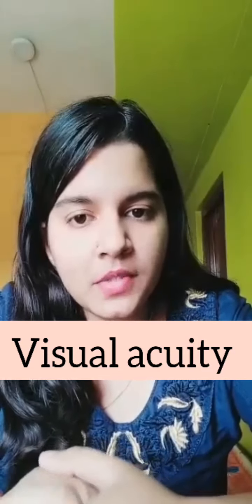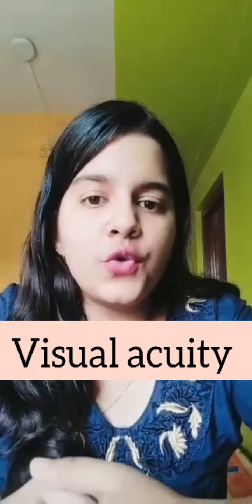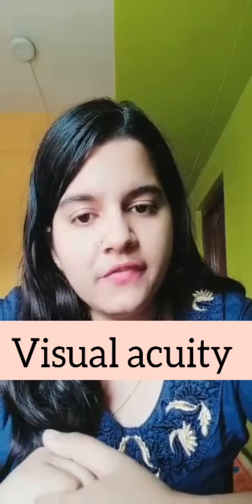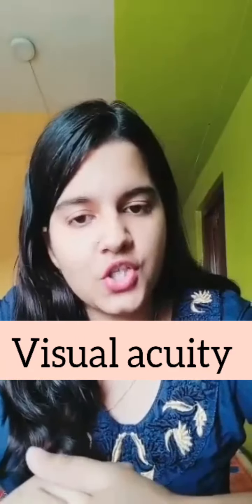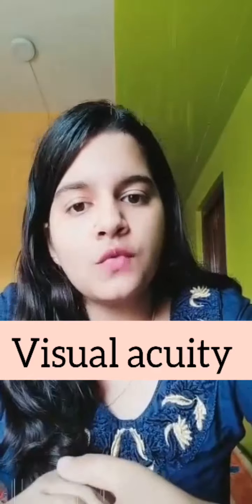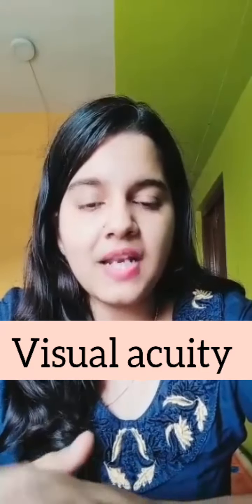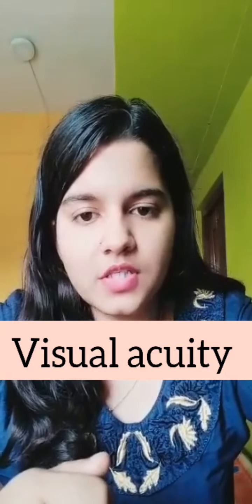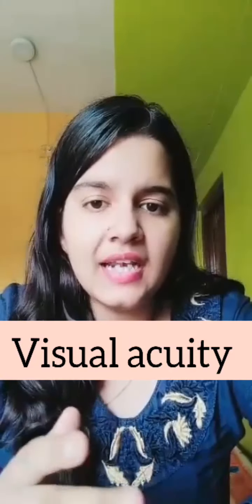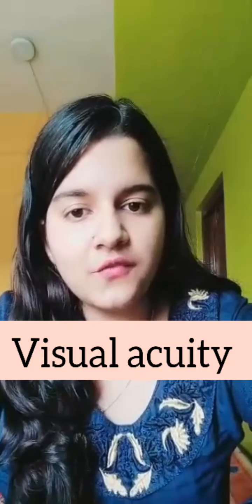And if the patient is not able to read at 3 meters, we start reducing the distance from 3 meters to 1.5, to 1, and even 0.5. If still the patient is not able to read, we move to the hand movement, finger counting, light projection and light perception part. And now the same thing would be done for near vision testing. While near acuity testing, we give a chart to the patient with a paragraph type of text written. We don't give particular words. There is a passage of lines there, and the patient is told to read from their normal reading distance, at whatever distance they are comfortable with. And in this way we make the assessment of visual acuity for distance and near.